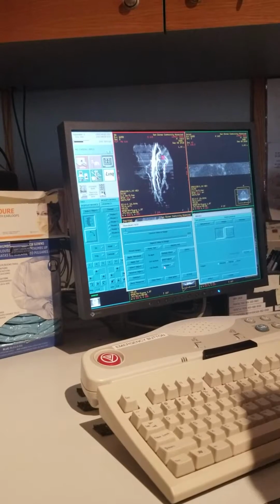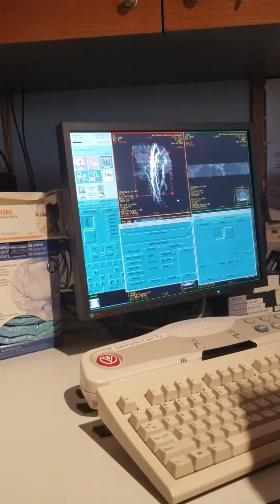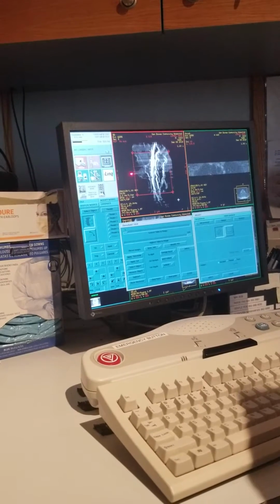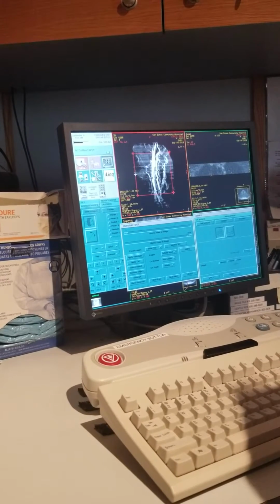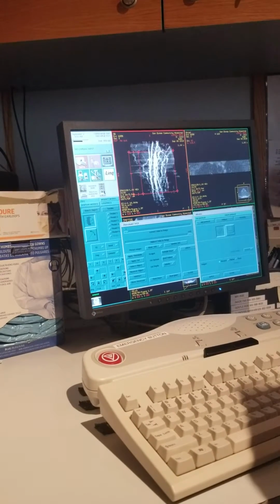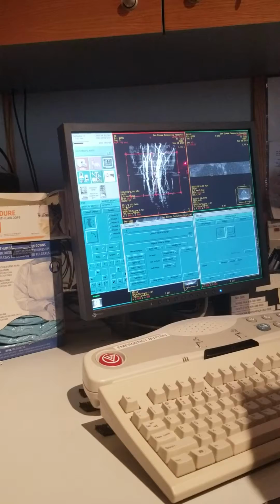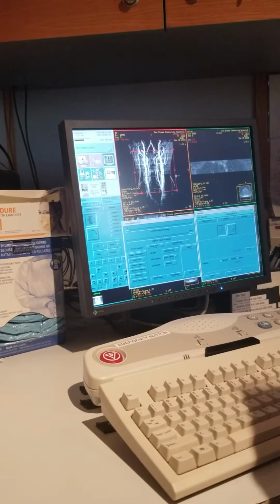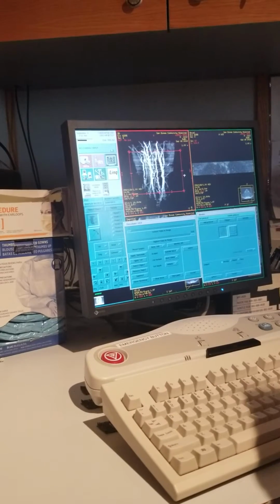If you go back into this, you've got this edge, which you can take this volume and move anywhere you want on the edge. So grab the edge and just move it in. As you see, you can see all this outside soft tissue.